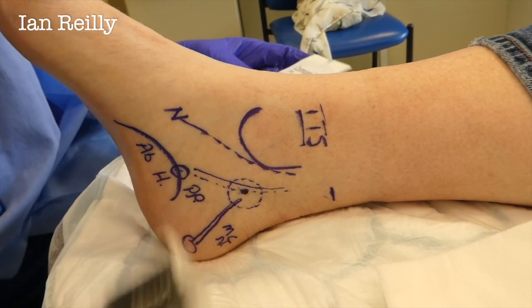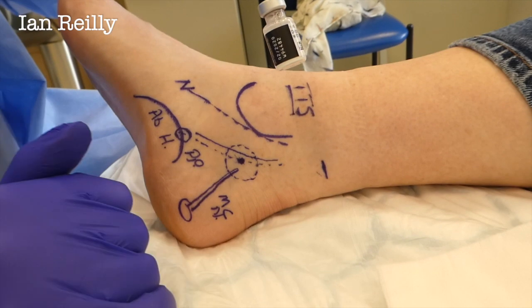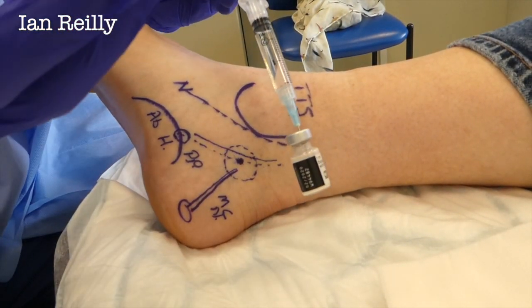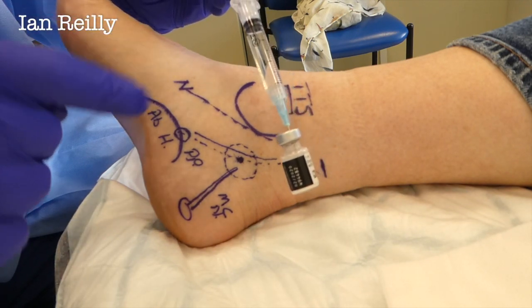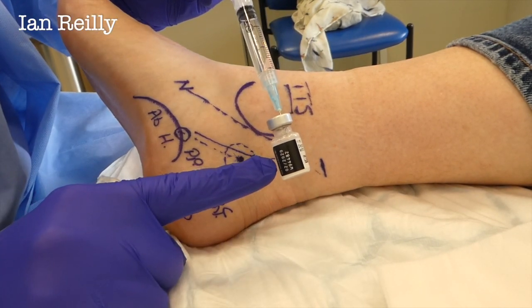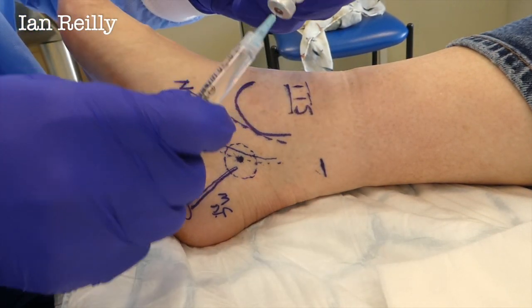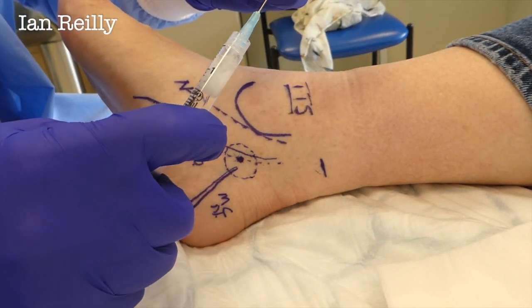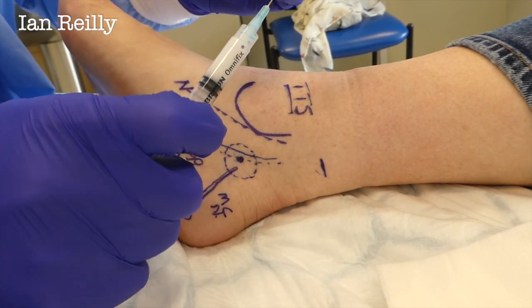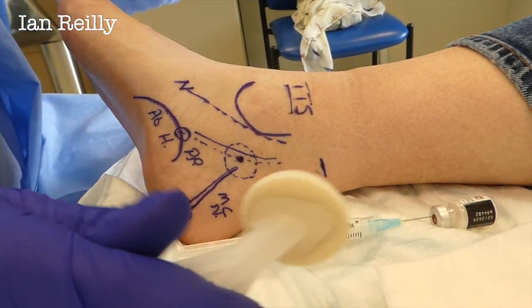What I've prepared is some local anesthetic — that's going to take the pain away, dilute the steroid, and also diagnostically, if it takes away the pain it tells me I'm in the right area. Mixed with a little bit of cortisone, that's going to be the anti-inflammatory. Just a point to the people watching this video: you can only really mix in the syringe if you are a prescriber, so you need to do that course.